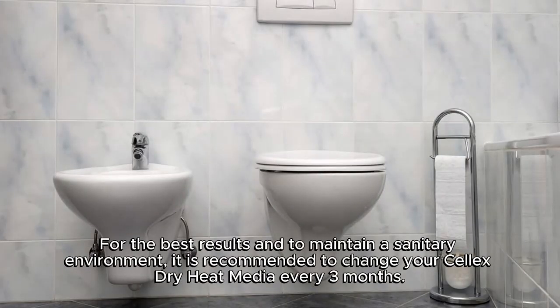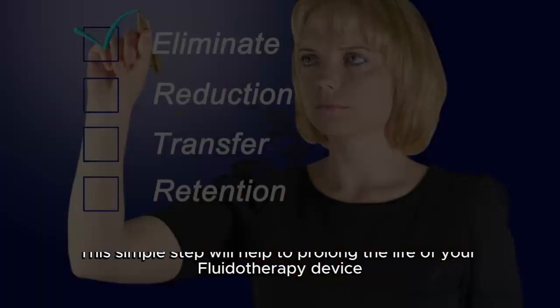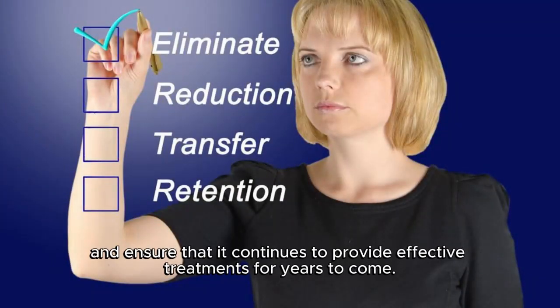For the best results and to maintain a sanitary environment, it is recommended to change your Cellex Dry Heat Media every 3 months. This simple step will help to prolong the life of your fluidotherapy device and ensure that it continues to provide effective treatments for years to come.